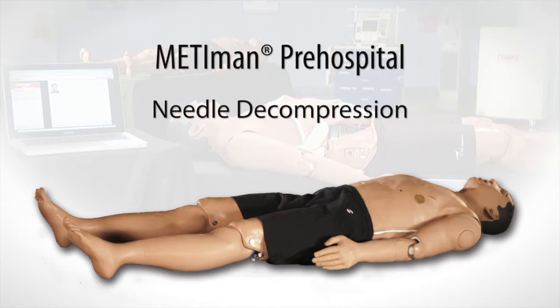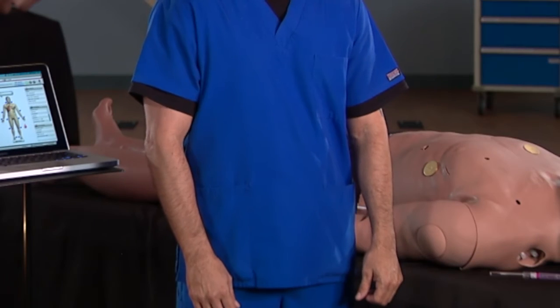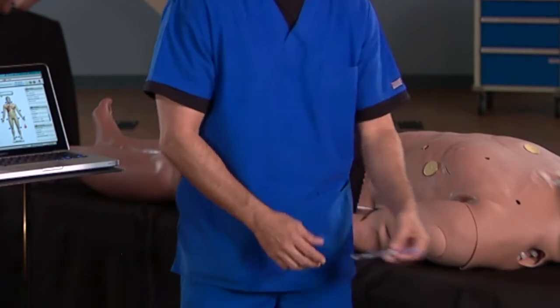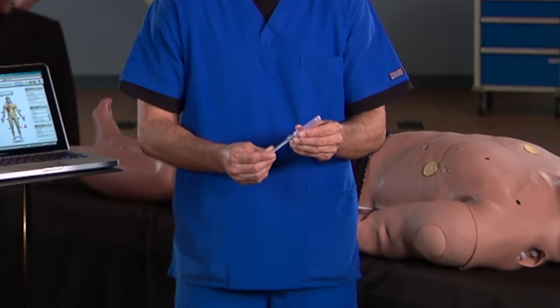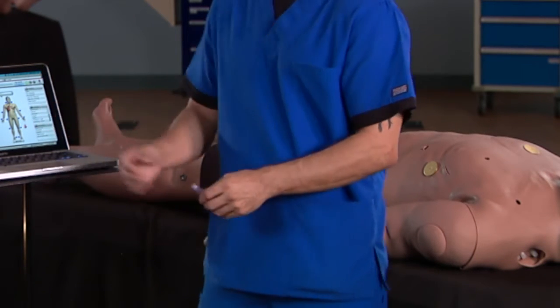This video shows you how to use Mediman Pre-Hospital's Needle Decompression feature. Use a 3.5-inch long, 14-gauge needle to perform needle decompression on Mediman Pre-Hospital. You'll also need the instructor workstation running an SCE.